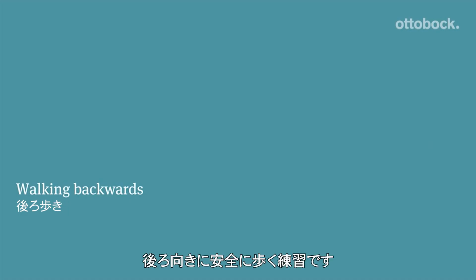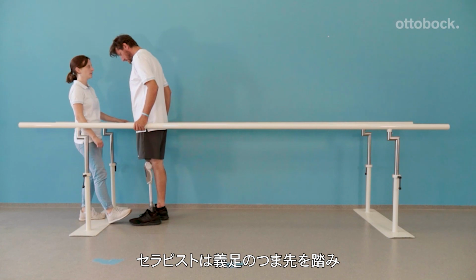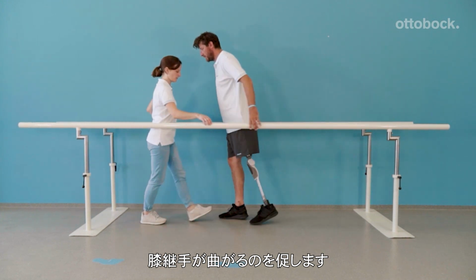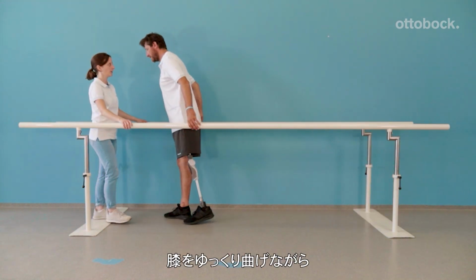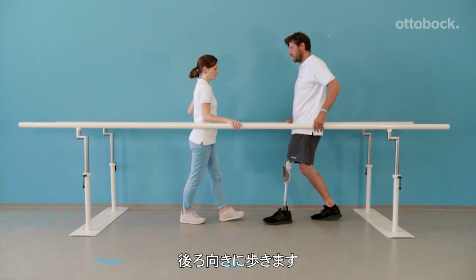With the 3R85 knee, it is possible to securely walk backwards. The therapist shows our model this additional functional possibility. The therapist slightly holds the prosthetic foot down to encourage knee flexion. The model demonstrates use of the hydraulic stance flexion resistance and yielding into knee flexion.